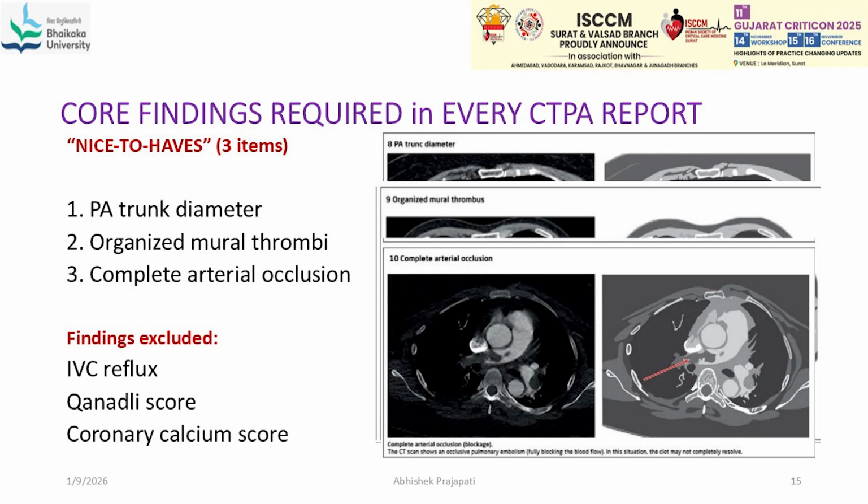And right ventricular hypertrophy: this is the right ventricular wall hypertrophy. In echo, we know that if the right ventricular wall is more than 4 mm, then we are dealing with right ventricular hypertrophy, and it suggests RV dysfunction. If it developed acutely, then we are dealing with acute pulmonary embolism, and if it has been there for a longer duration, then we are dealing with the chronic one.